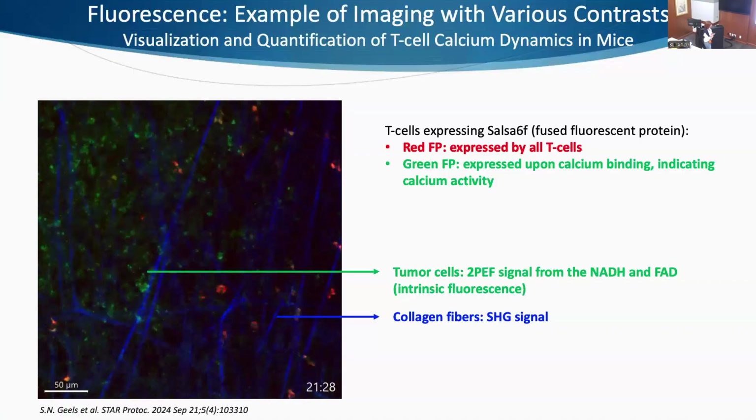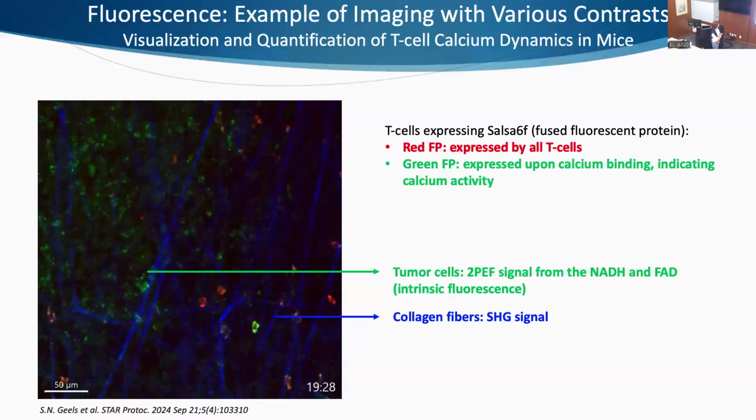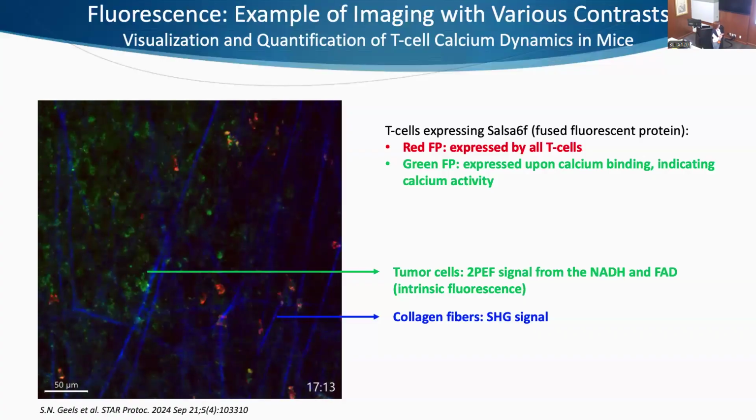And these cells, the T cells, are tagged by using a fluorescent protein.